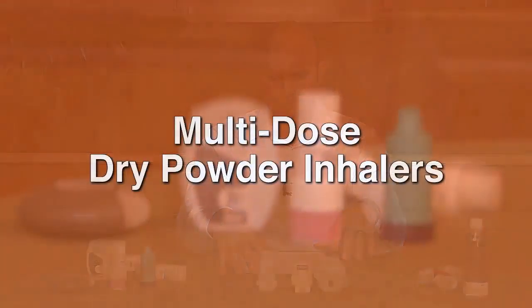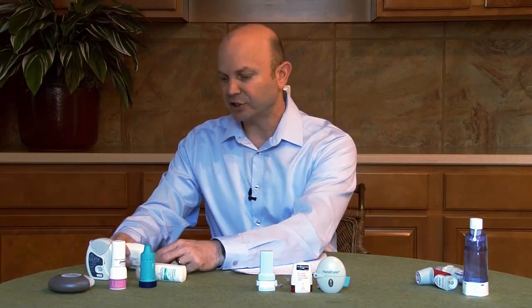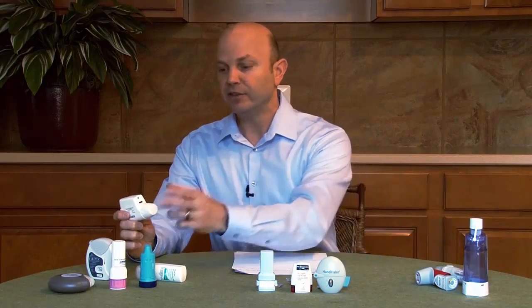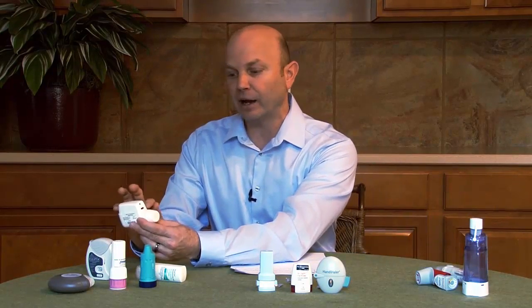Now we're going to talk about multi-dose dry powdered inhalers. These devices, you'll notice, all come with a counter. These devices you also do not need to clean. The other two devices need regular cleaning, and you should refer to the manufacturer's instructions for that. These devices, once they reach 0 on the dose counter, you will discard them and replace the entire device.